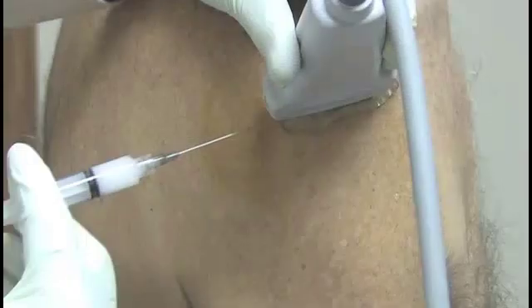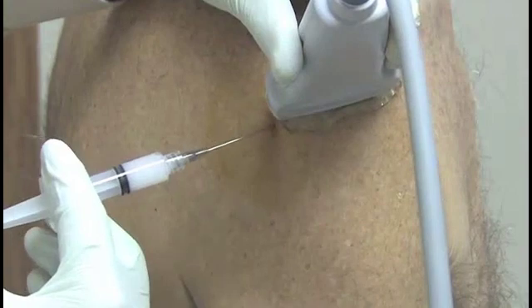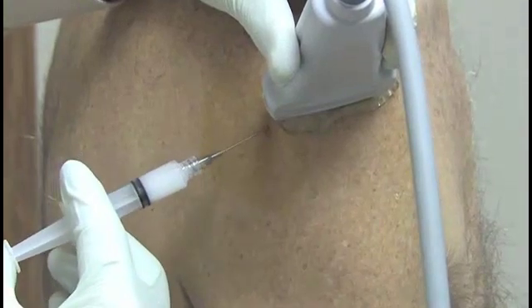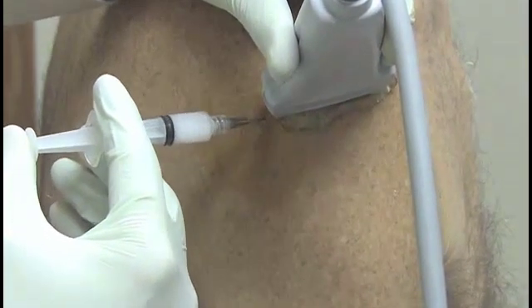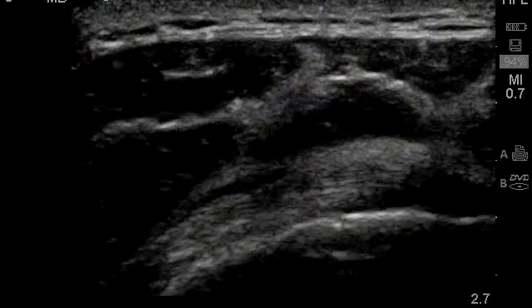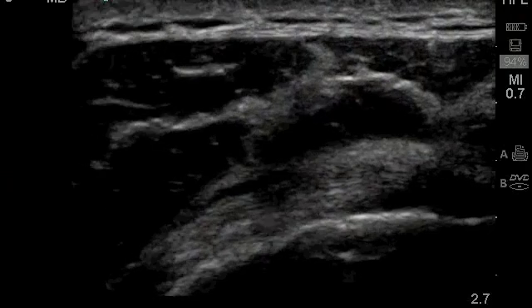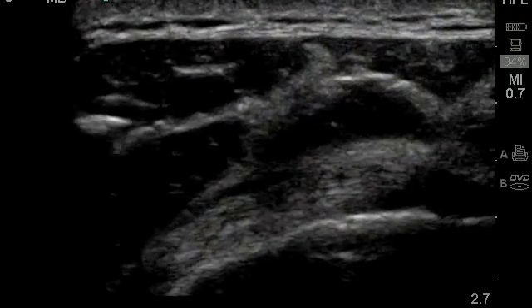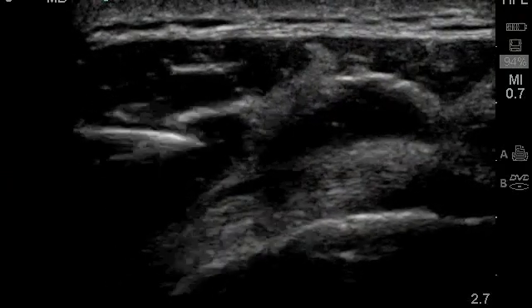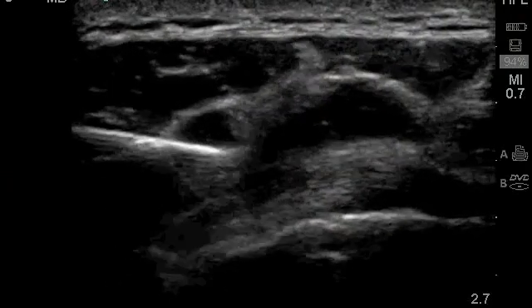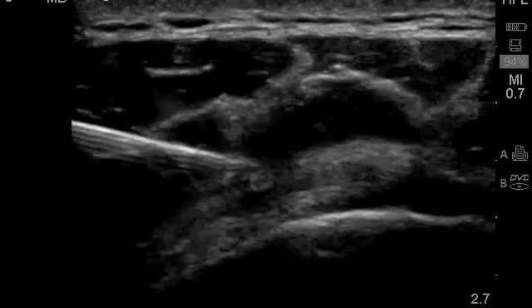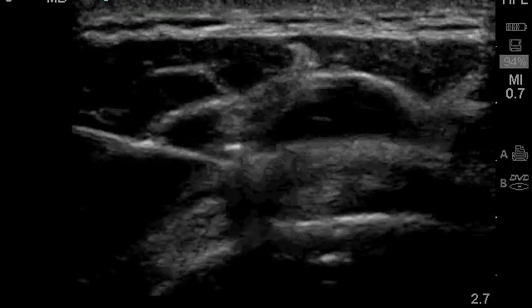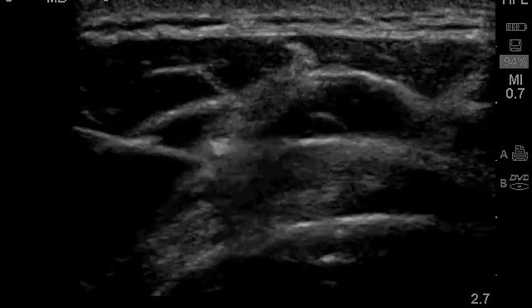You perform an ultrasound-guided injection of corticosteroids into your patient's subacromial bursa. You are able to identify the bursa on the ultrasound screen and to determine the optimal depth of needle insertion for the procedure. The injection is successful on the first attempt.